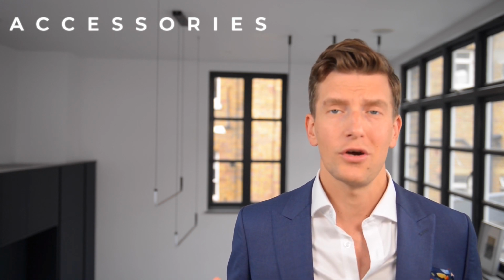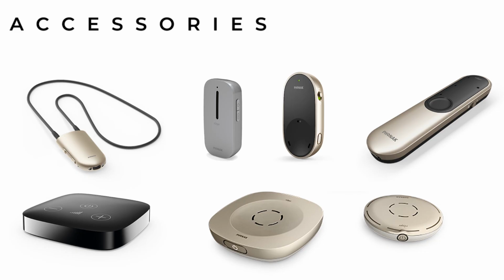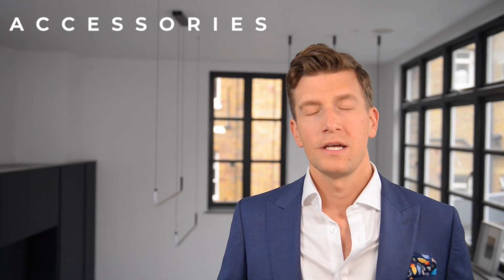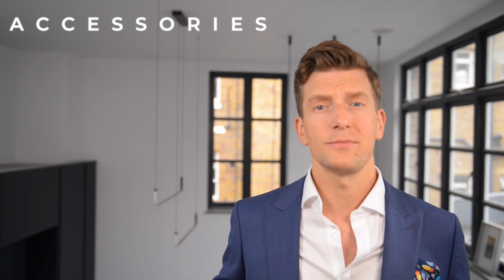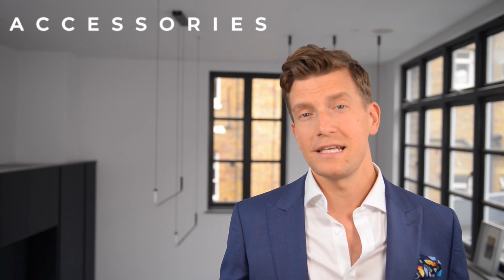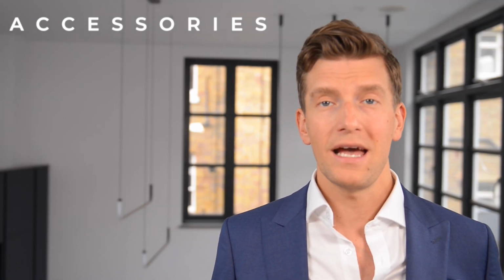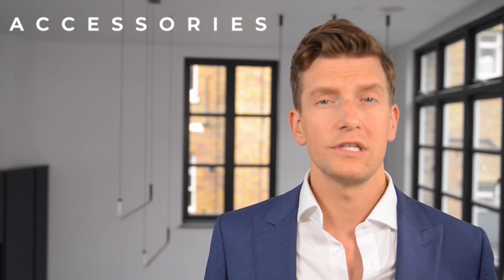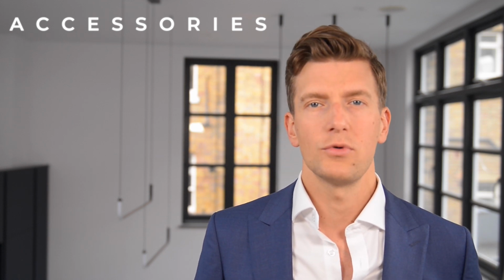Phonak have been great at recognizing where hearing aid technology alone will struggle to overcome certain hearing challenges and difficulties. So they have quite a broad range of accessories to be able to help you out in those areas, ranging from the TV streamer to the Roger FM range. Historically, hearing aid manufacturers have had to add an FM shoe onto the bottom of the hearing aids to be able to pick up FM systems. But what Phonak have cleverly done is they've integrated the FM receivers and the technology necessary to work with the FMs into the hearing aids already. So you can work with your audiologist to be able to pair these hearing aids to the extra accessories with no additional equipment necessary that's physically attached to the hearing aids. So it stops them from being any more cumbersome or any bigger.